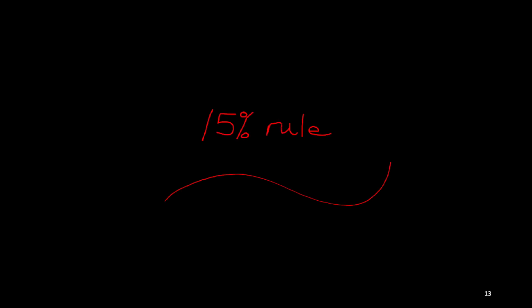The 15% rule. So a 15% increase in kVp has the same effect as doubling the mAs. A 15% decrease in kVp has the same effect as decreasing the mAs by half. Increasing the kVp by 15% increases the exposure to the IR unless the mAs is decreased. Also, decreasing the kVp by 15% decreases the exposure to the IR unless the mAs is increased.